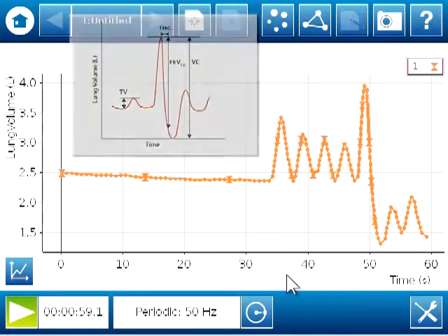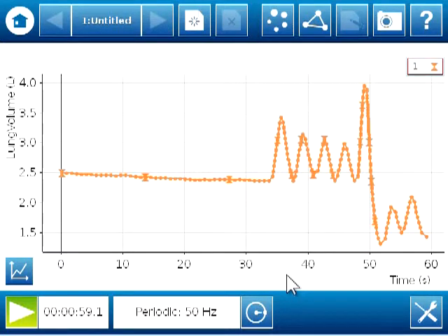In part 2 of this series, we'll go ahead and take a little more time to analyze this data, but now you've seen how to set up your spirometer with a calculation for volume and how to begin data collection.